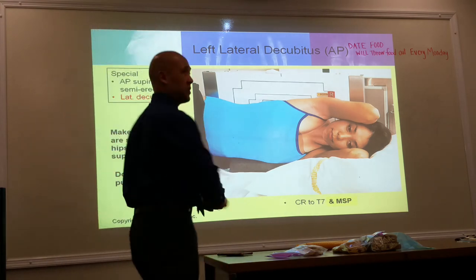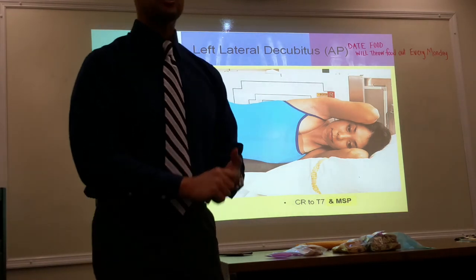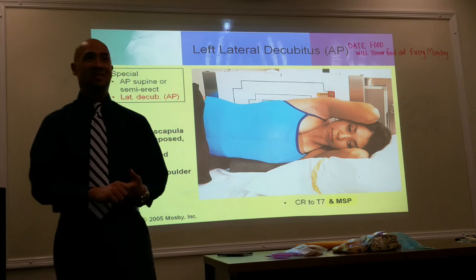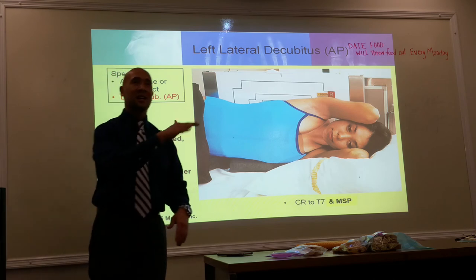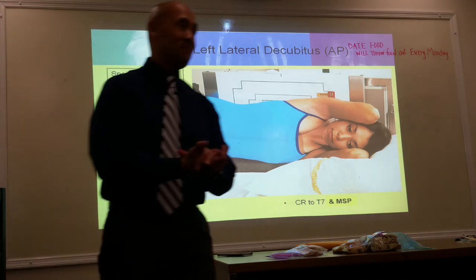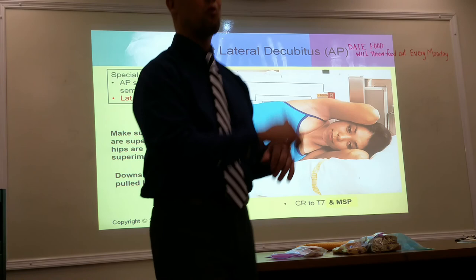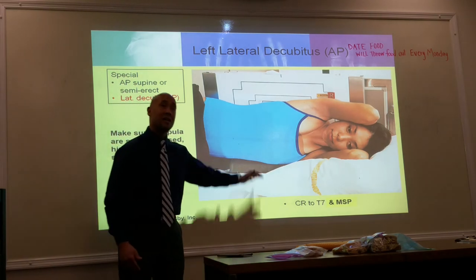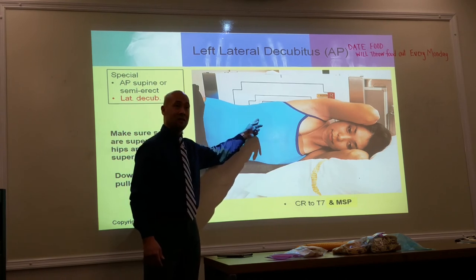If we were looking at pneumothorax, we're looking for free air in the pleural cavity. You guys all know what pneumothorax is, right? If we're looking for pneumothorax, air in the pleural cavity, which lung are we looking at now? Are we looking at the lung that's side down? No. Or are we looking at the lung that's side up? Side up. Which brings to point, get good history on your patient to make sure that you are performing the right position and projection. For air, we're looking at the side up. For fluid, we're looking at the side down. So in the left lateral decube, for pneumothorax, we'd be looking at the right side. Does that make sense?